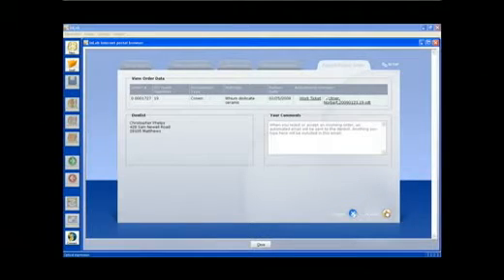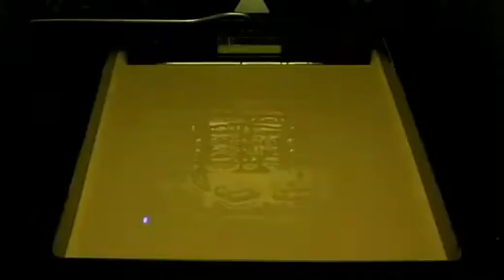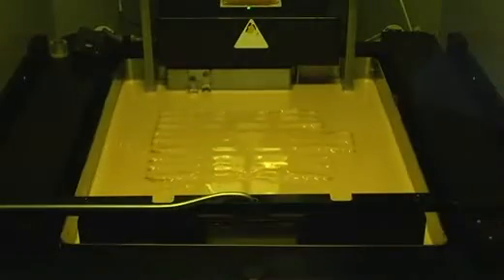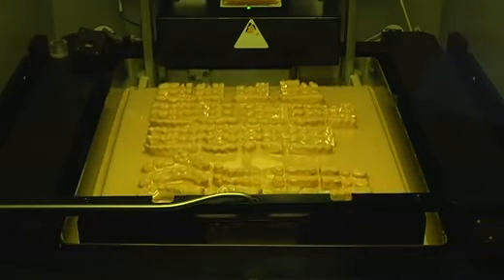Upon acceptance of the case, a physical model can be ordered from Infinident, and the lab can begin fabricating the zirconium oxide framework for the bridge. In the meantime, Infinident will start fabricating the models using the latest rapid manufacturing technology. Unlike conventional models that are subject to dimensional changes from impressions and stone, digital models are dimensionally stable and are an exact representation of the situation in the patient's mouth.